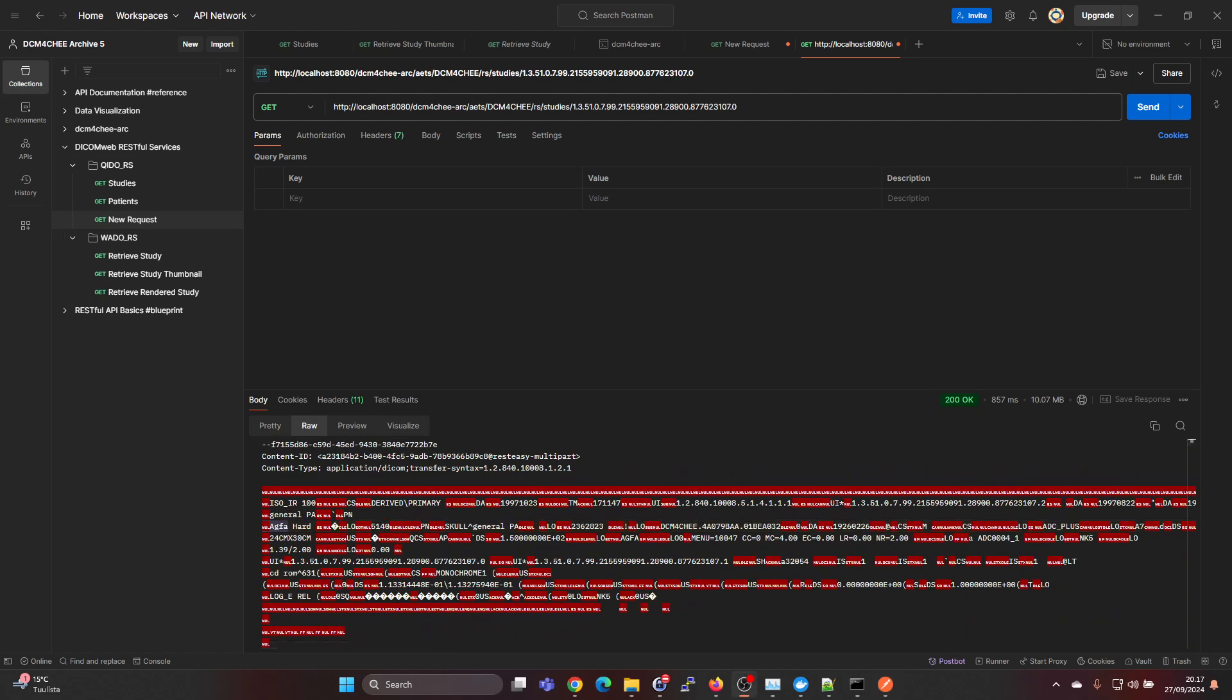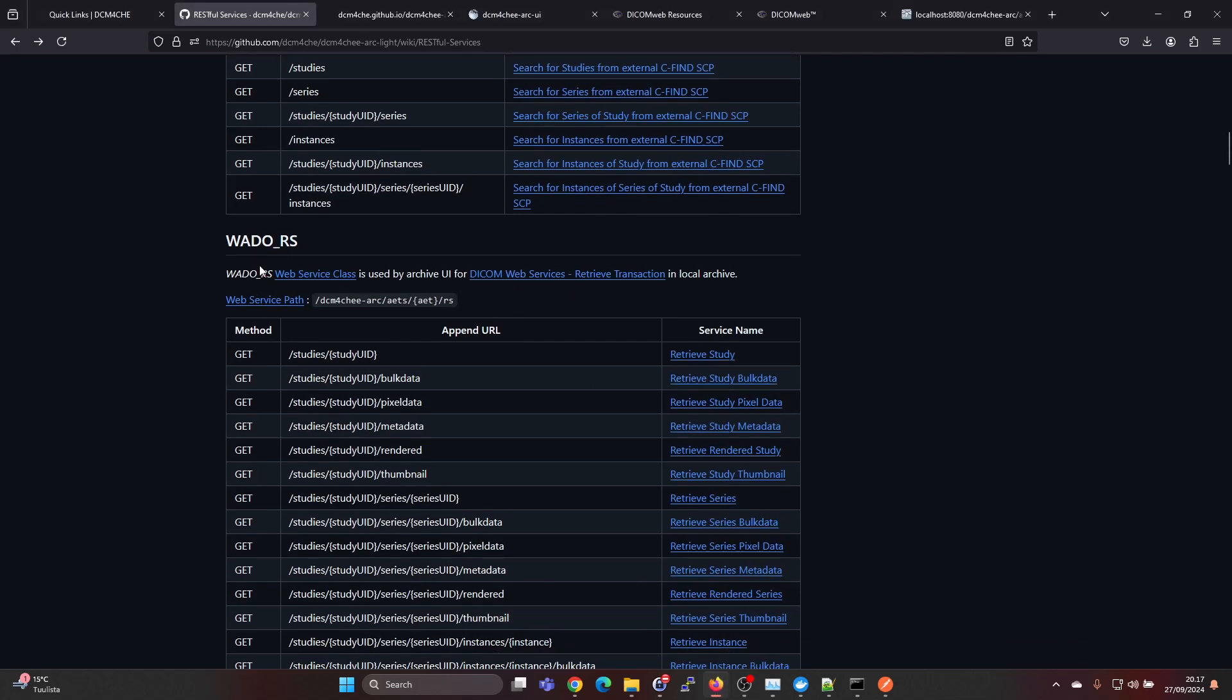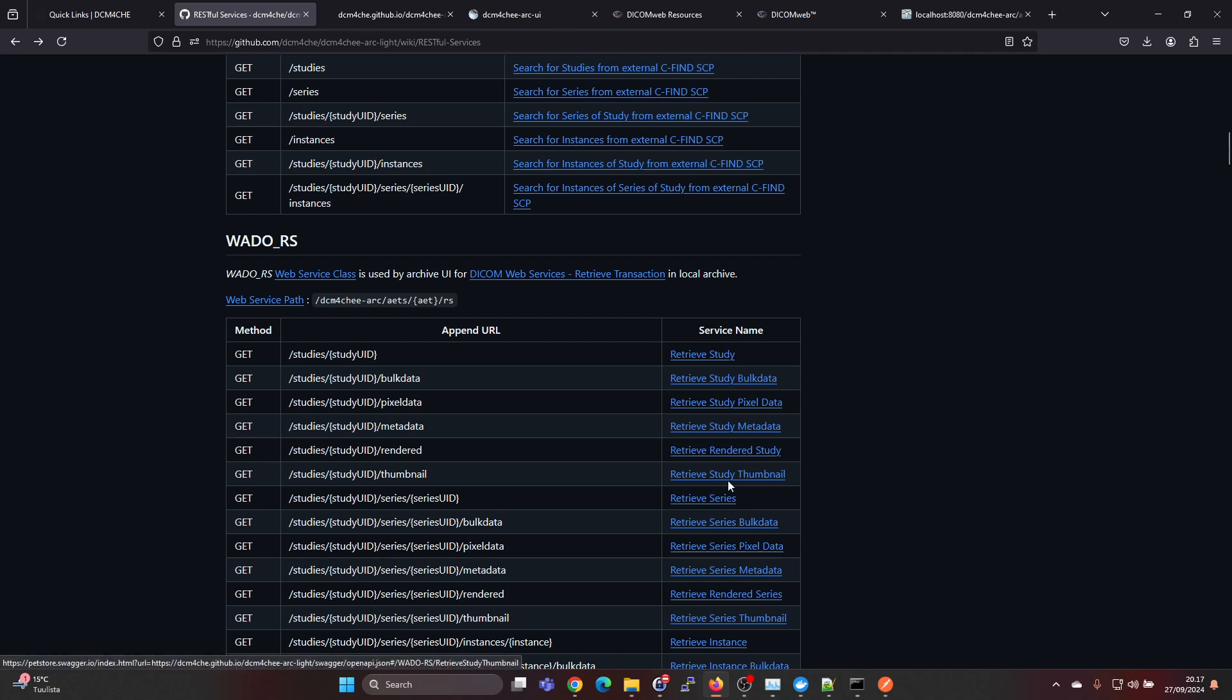Since Postman is not capable of visualizing a DICOM object directly, this is not very interesting here inside Postman. But we can go ahead and check what other services WadoRS can provide. For example, we have a retrieve study thumbnail here.